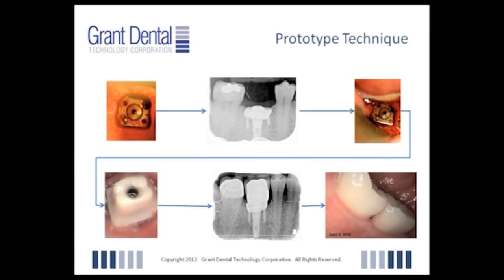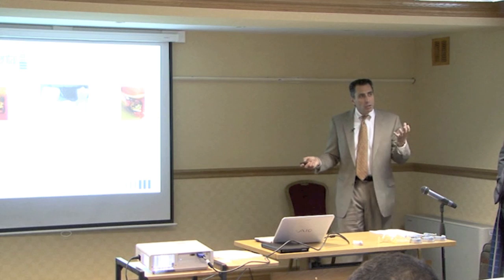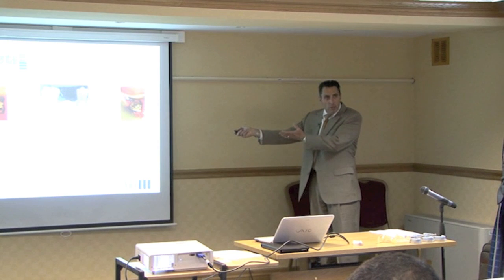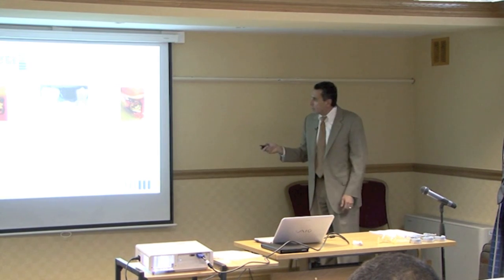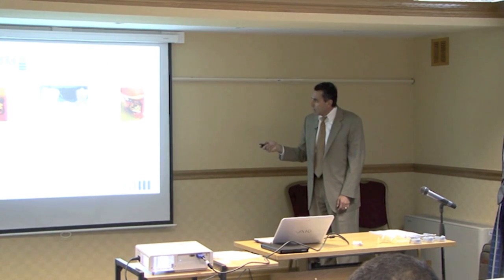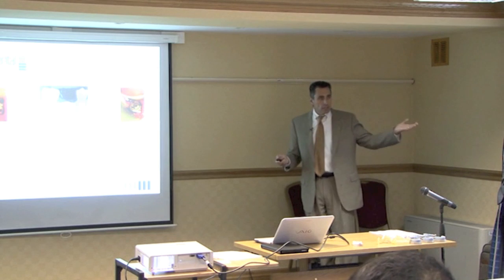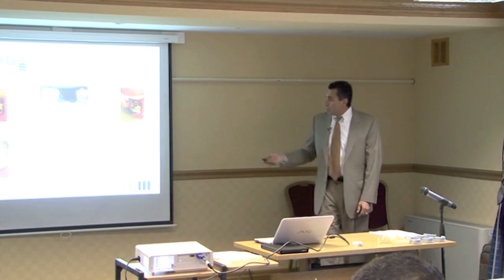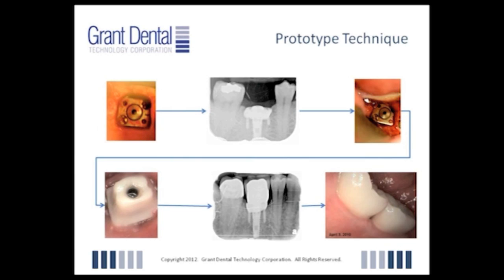When we opened them up after 3 months, if you look closely here, you see this? It's bone. It's all integrated. You can even see here it covered the screw. So we knew, based on this, that it integrates. Bone grows over the top of this. It's very friendly. But because we only had this small little cover screw, we had to remove the bone in order to get access to restore it, which we did. And then we made custom abutments, and then we restored the tooth.